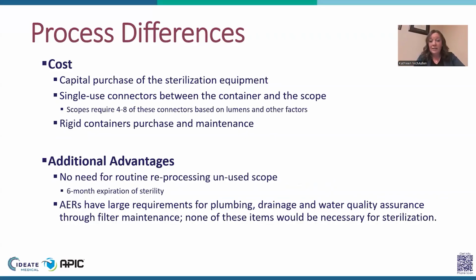Our study was not intended to do a deep dive into cost estimates, but we offer just some thoughts about it. Capital purchase, of course, for sterilization equipment. If you were moving from an AER to a sterilizer, it would be a new equipment purchase. If you were at a spot where you're going to have to buy new AERs anyway, it's pretty similar. As mentioned, the connectors within the sterilization container are single use, so there is some consumable cost there. And then we also just discussed the fact that rigid containers do have a cost at purchase as well as a small maintenance fee.